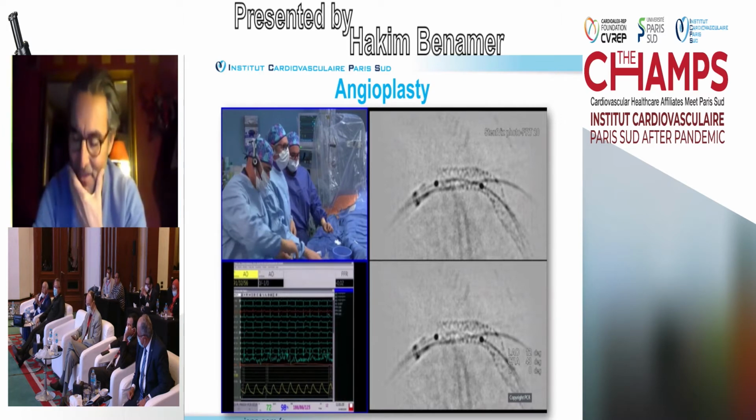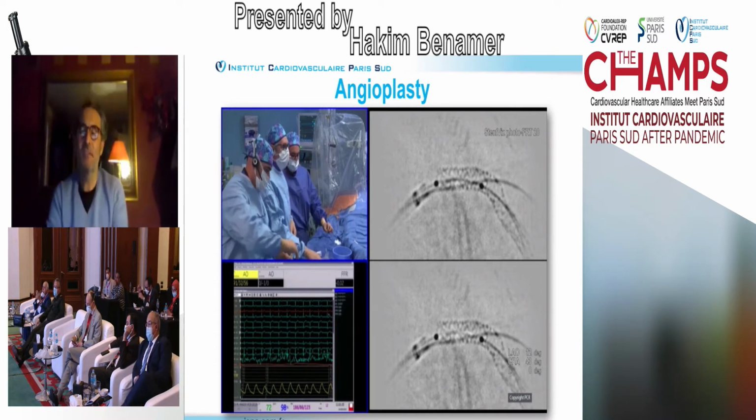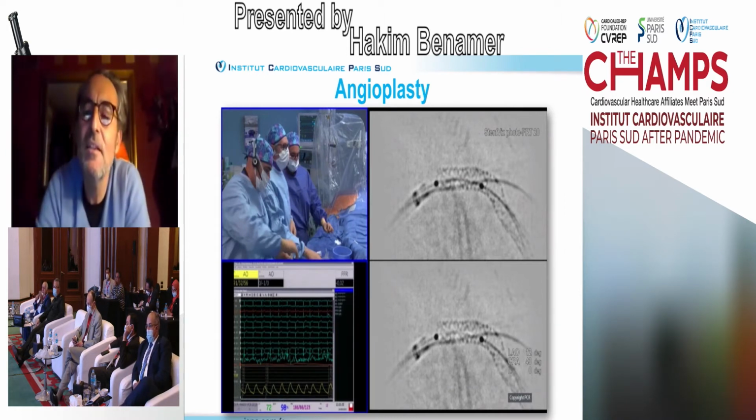If we have 2 wires, and in my mind I'm going to do 1 stent, and the big vessels are big, so I go for 6 French. Depending on the anatomy and what you are going to do, 6 French can be beneficial. As my colleague said, according to the manufacturer, not all 6 French catheters and not all balloons can accommodate 2 balloons, because some balloons cannot be used 2 at a time in a 6 French diameter.